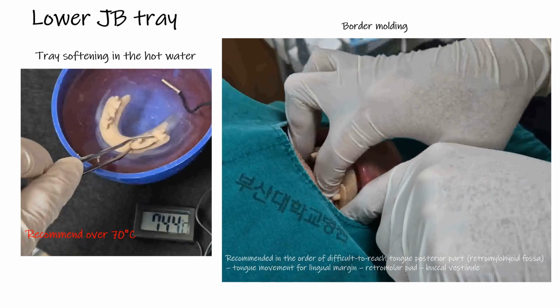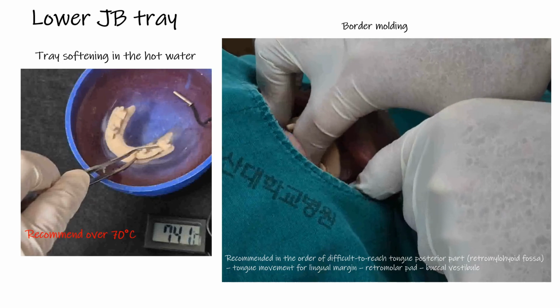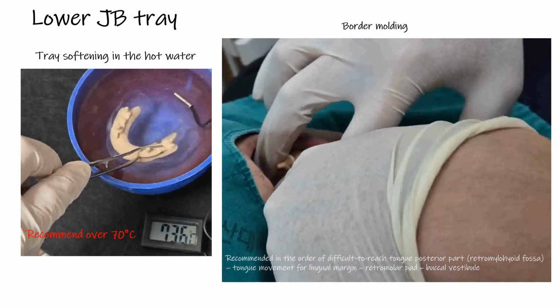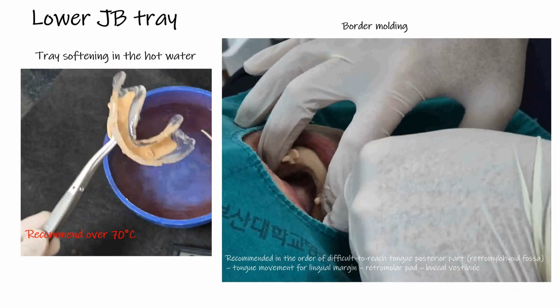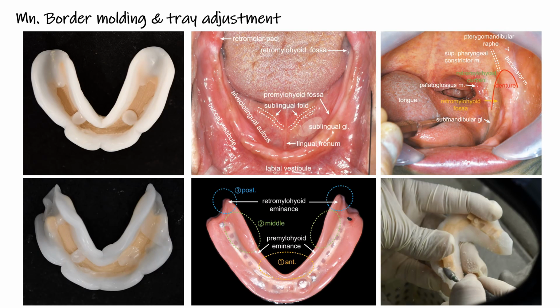With enough time for border molding, you will be able to achieve a precise final impression. The final molded tray should have the ideal thickness and retention form for a stable fit, even in patients with severe bone resorption.